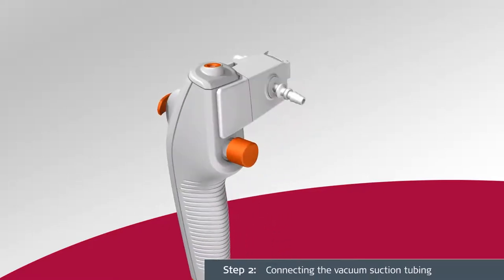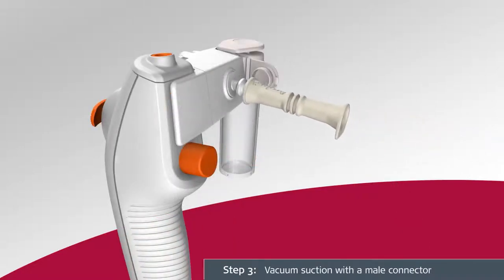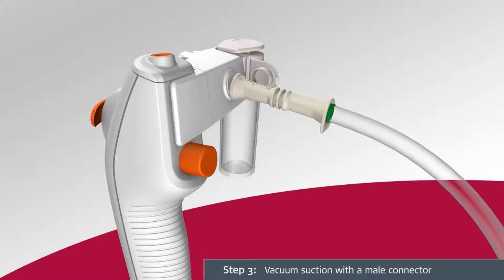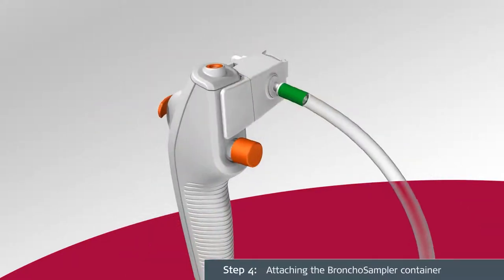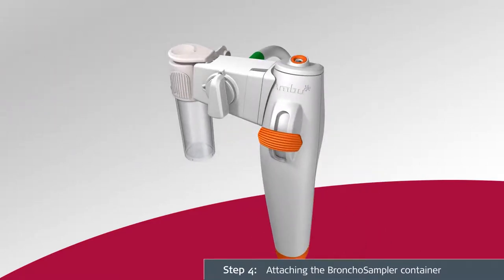Carefully connect the vacuum suction tubing to the suction connector in accordance with the supplier's instructions. If the vacuum suction tubing has a male connector, use the suction adapter to ensure a secure connection. Attach the sample container to the sampler bridge by aligning the connection interfaces and pressing the sample container towards the bridge firmly until it clicks into place.